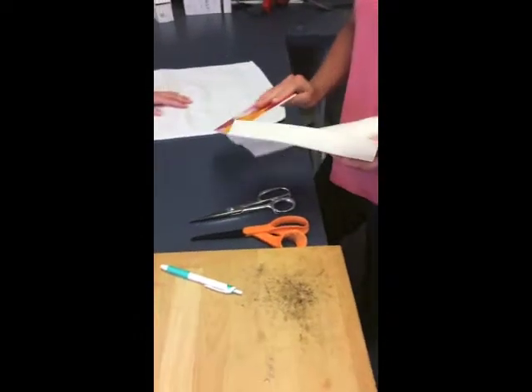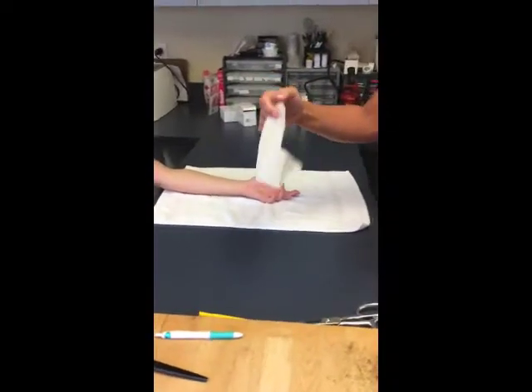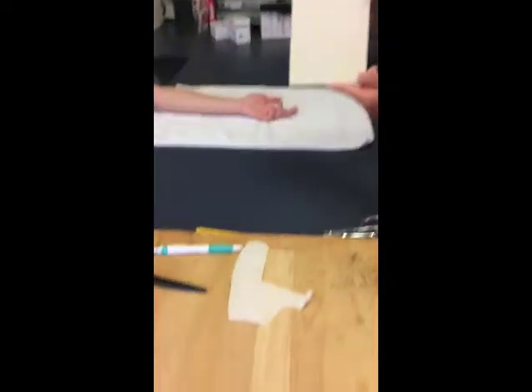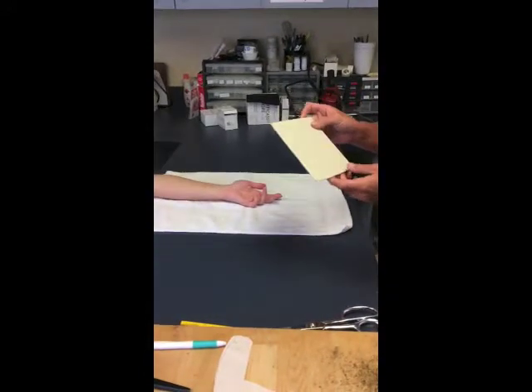Now I'm going to cut it out after I trace it on the pattern and put it in the heat pan to warm it. I cut out the pattern on the paper towel and then traced it on the thermoplastic material. Now I'm going to put it in the splint pan to heat up, and then I'll cut it out.